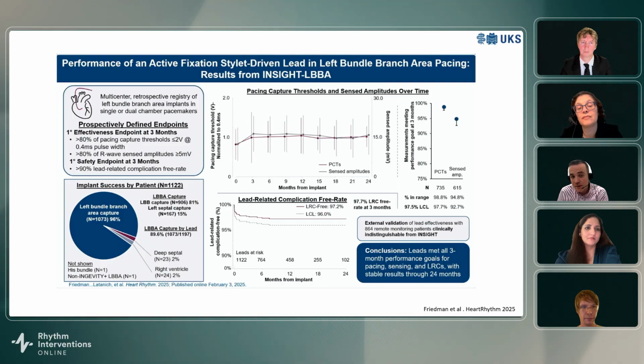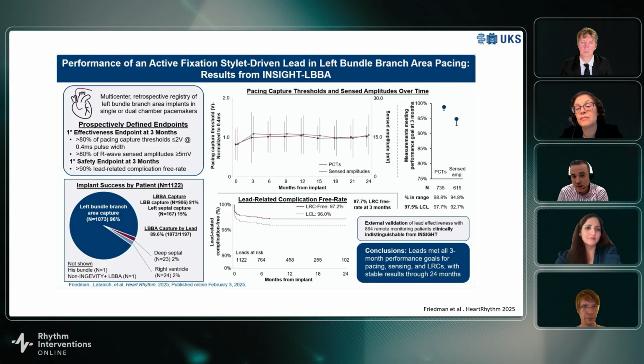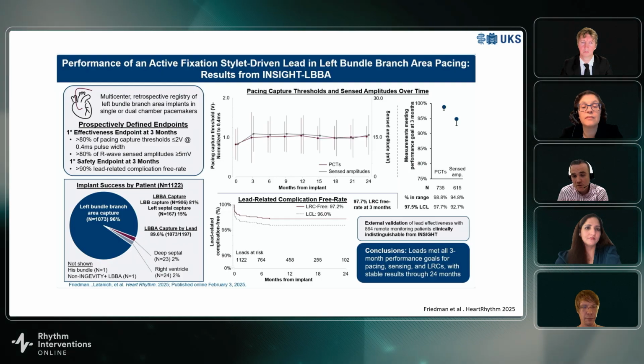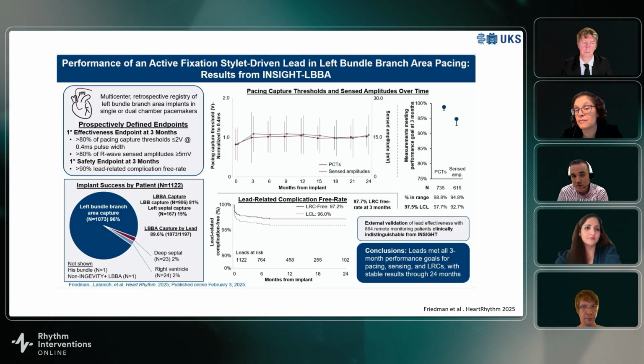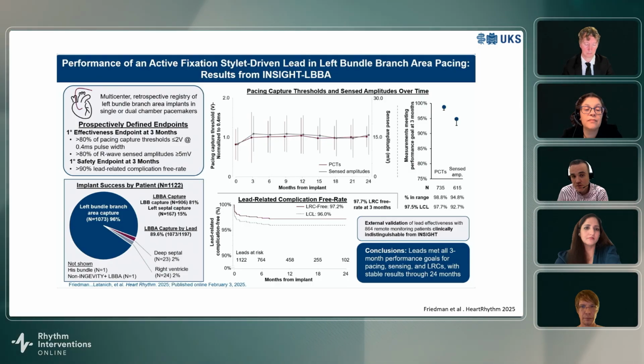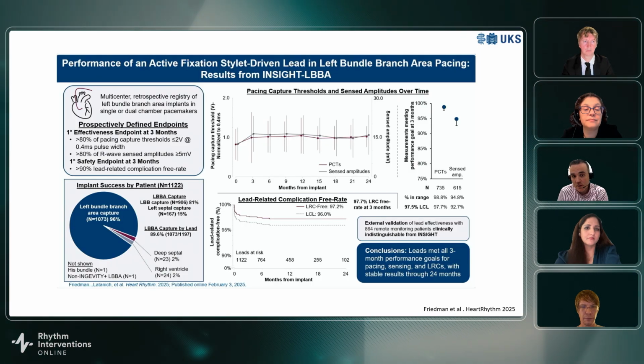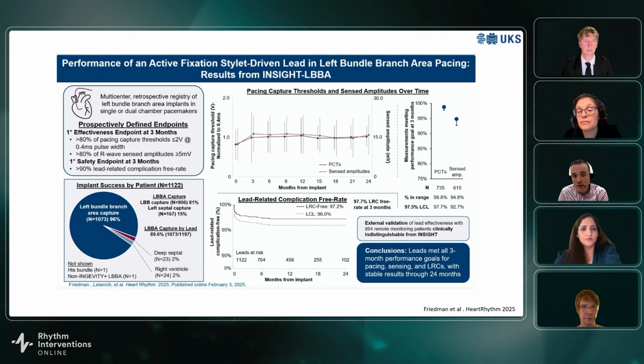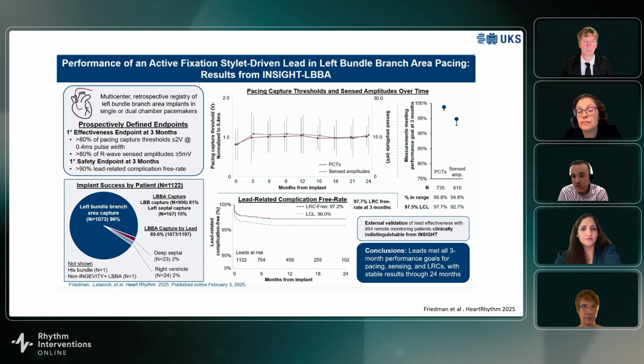And first of all, we can see the implant success rate, which was very high, at 96%. The primary endpoint of the study was the efficacy of the lead. It was measured by the maintenance of the capture threshold during follow-up and the sensing amplitudes. The safety endpoint was also very important at 3 months, defined as freedom from lead-related complication, more than 90% during the 3 months of follow-up.